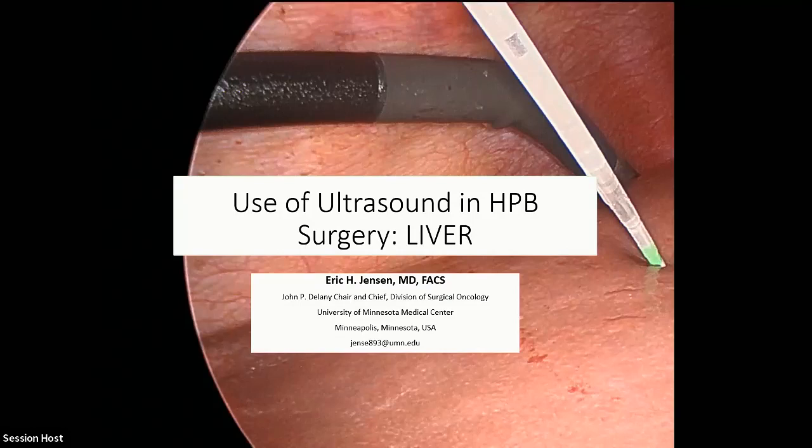And I just want to expand on one thing Dr. Visser said, which is when you're looking at pancreatic anatomy and you're looking for a tiny duct, you have to be very careful to have a light touch on the pancreas when you're using ultrasound, because if you put much pressure at all, you'll suppress the duct. It makes it really hard to see. So that's a time where having some saline in there, or what some people call a standoff approach, where you put some water on it and have the ultrasound either a very light touch or even floating in the pool, is sometimes a good way to figure that out if you're looking for a really tiny duct.